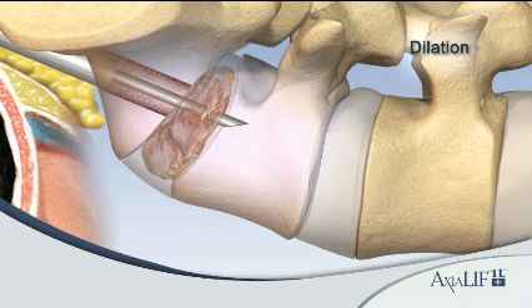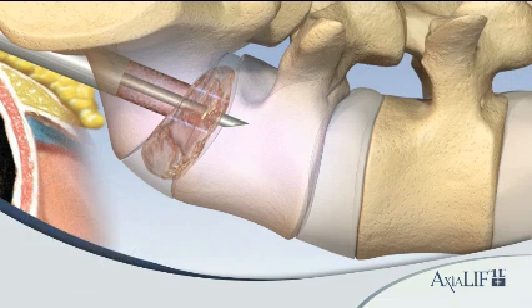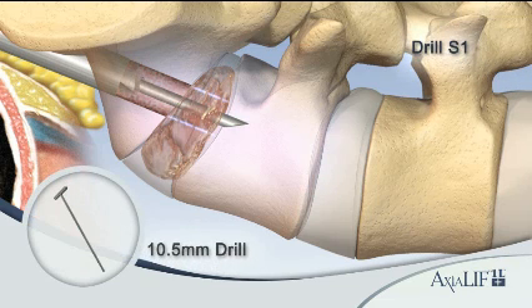Remove the 10 millimeter sheath with the 8 millimeter dilator. Insert the 12 millimeter dilator and sheath into the working channel. Remove the 12 millimeter dilator and leave the 12 millimeter sheath in place.